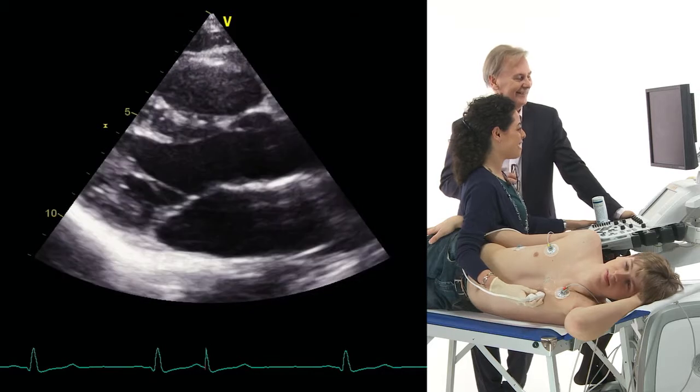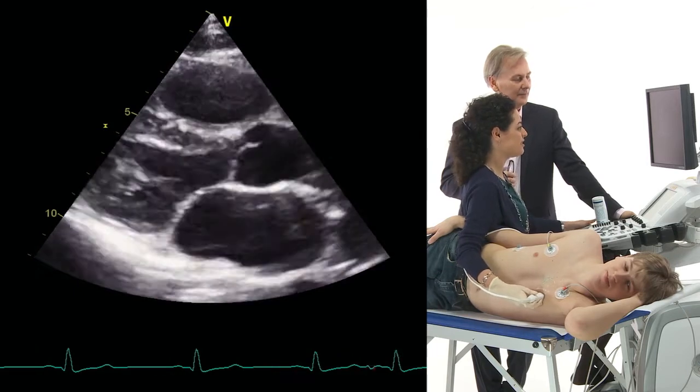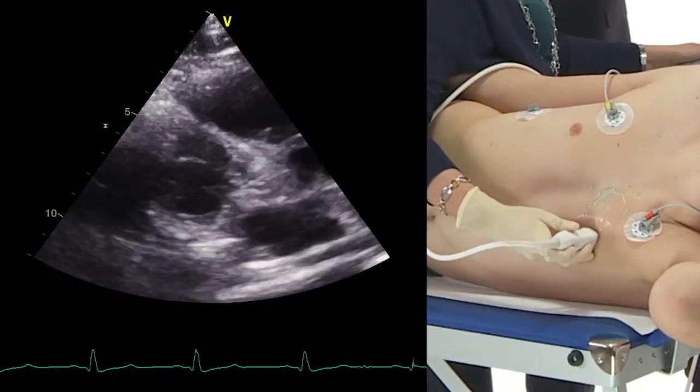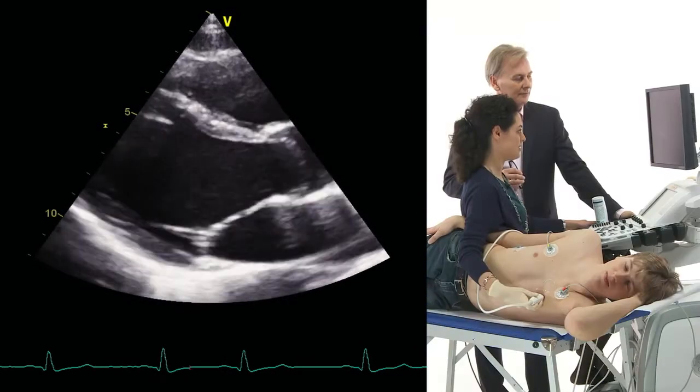Actually, we can really appreciate the total apparatus of the mitral valve when we do image the heart, and these structures you are looking at are only chordae and papillary muscles. The only thing we need to do is scanning the aorta. The mitral valve, we do just tilt the probe anterior and posterior, and we get a full view of the mitral valve and its apparatus.